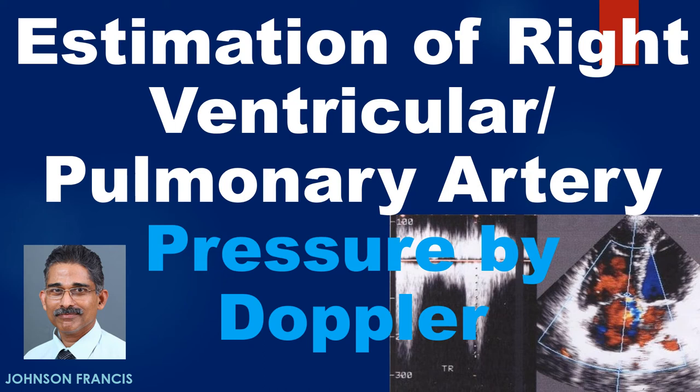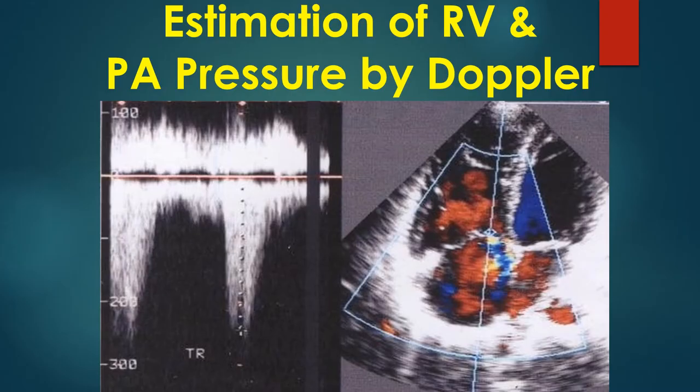Estimation of right ventricular systolic pressure by Doppler echocardiography is done from the apical four-chamber view. The colour Doppler image shows the bluish mosaic tricuspid regurgitation jet behind the closed tricuspid valve, along the interatrial septum into the right atrium.